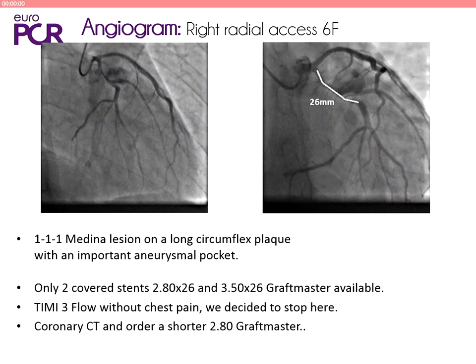One more question, please. Yes. Do you have mesh-covered stents like MGuard in your lab, and what's your experience with it? In our lab, we have only graft master. We use only graft master.